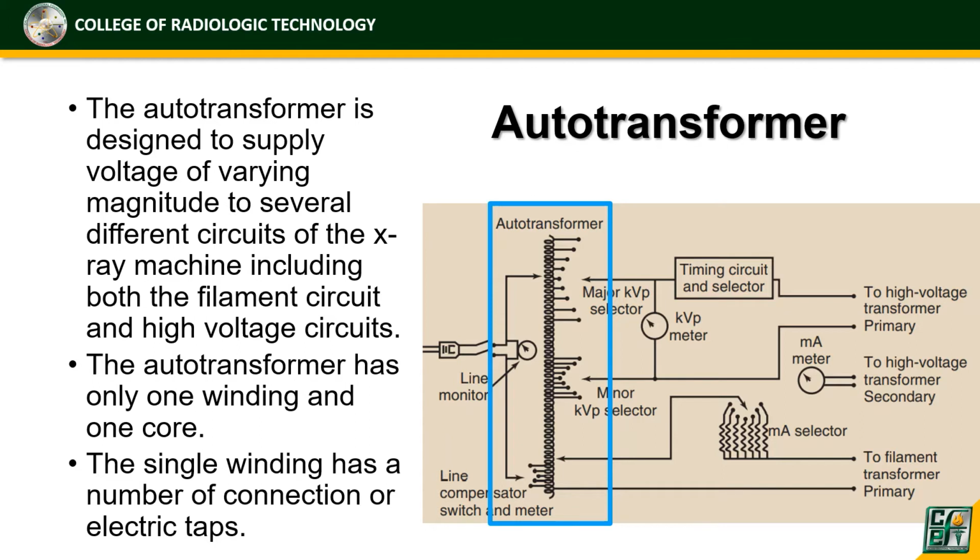But this single winding can have a number of connections or electrical taps. As we can see here, there are different taps for the different kilovoltage peak.